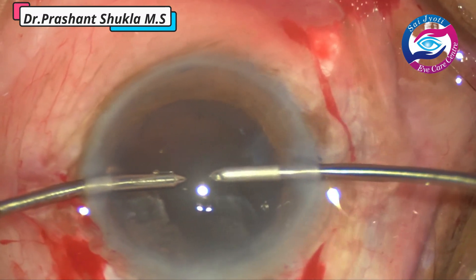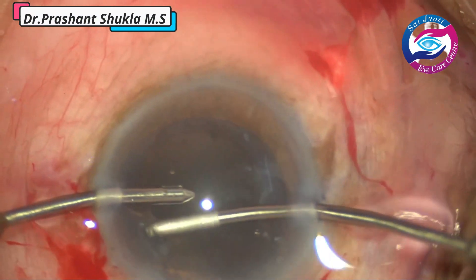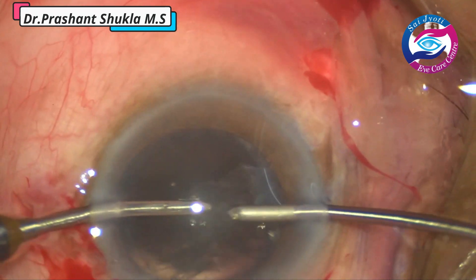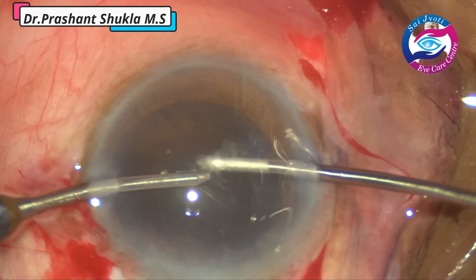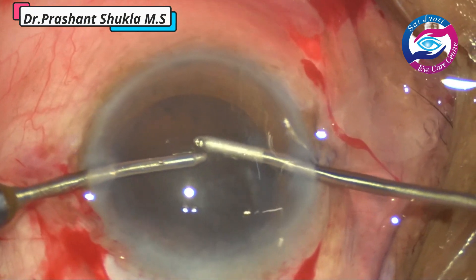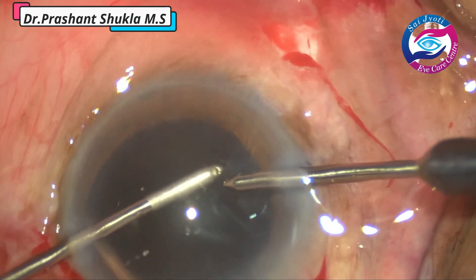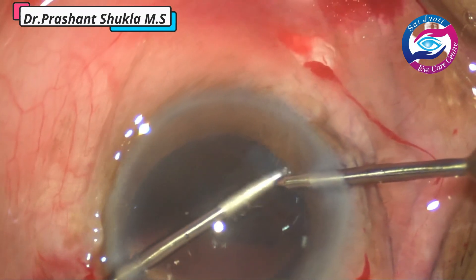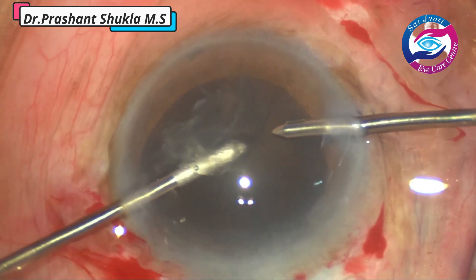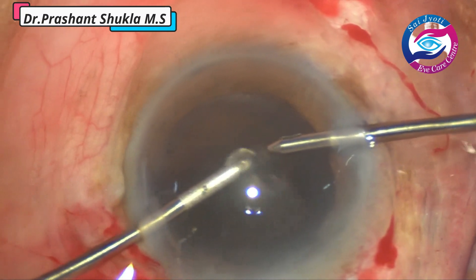Whenever residents or students in training have access to bi-manual irrigation aspiration, it is a good idea to use this technique for all their SICS cases. Bi-manual irrigation aspiration is a very good tool to remove the cortex with greater safety. The handpieces are small and they can go through a MVR opening of 23 or 20 gauge — we don't have to make a very big side port as we do for Simcoe. It is also very easy to remove the sub-incisional cortex, which is slightly tougher using Simcoe.